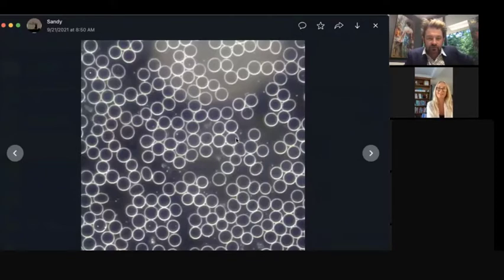That's my blood, yeah. When we're looking at live blood analysis, the little bubbles you can see are your red blood cells. We want them to be lovely and round and roughly the same shape and size. And the membrane edge is very, very important as well, to have a healthy membrane. We also want a negative charge on the outside of the cells so the cells aren't attracted to each other and don't start stacking. We want it all free-flowing and lovely, and that's kind of like a perfect blood sample.